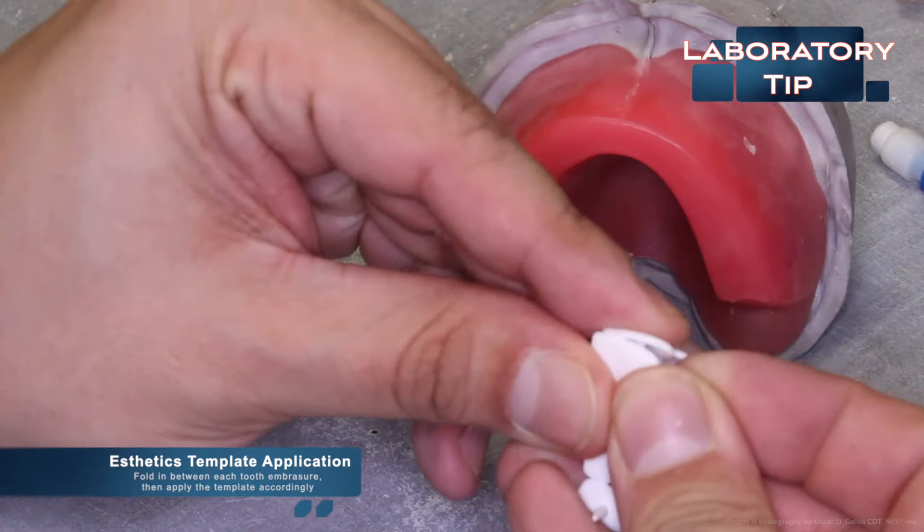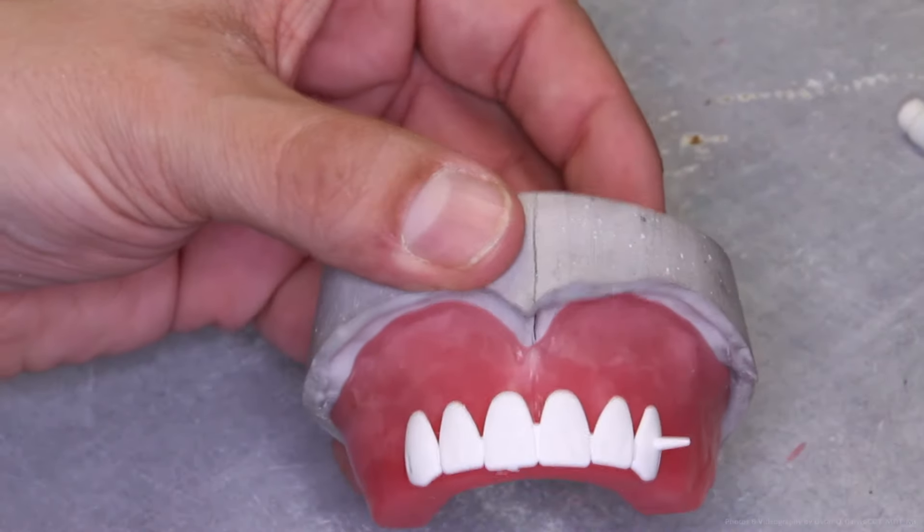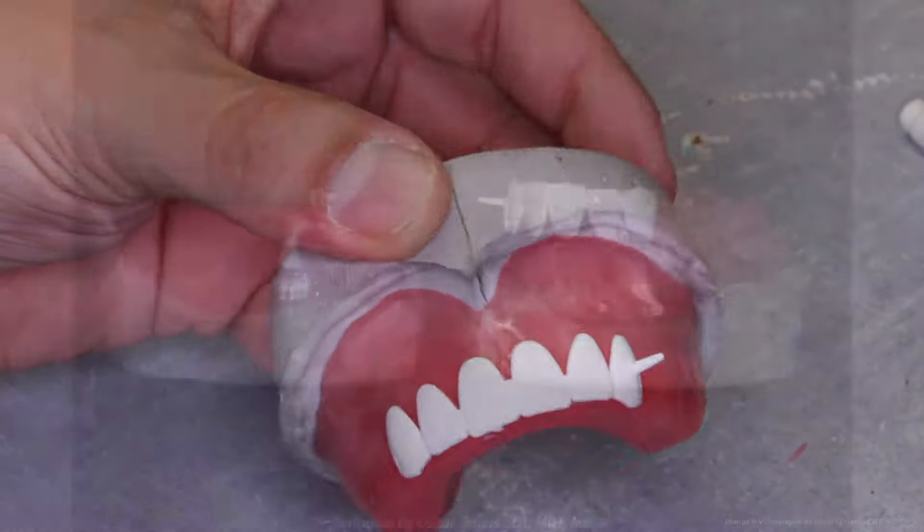Remember that these occlusion rims are used to evaluate the patient's intraoral environment. Without teeth in place, it may be hard to visualize where teeth should be when looking at a solid pink block of wax. By using an aesthetic template or setting some initial teeth, it can aid in the evaluation process. The use of the aesthetic template aids in midline determination, smile design, and can reduce try-ins — it can also be performed by the clinician.